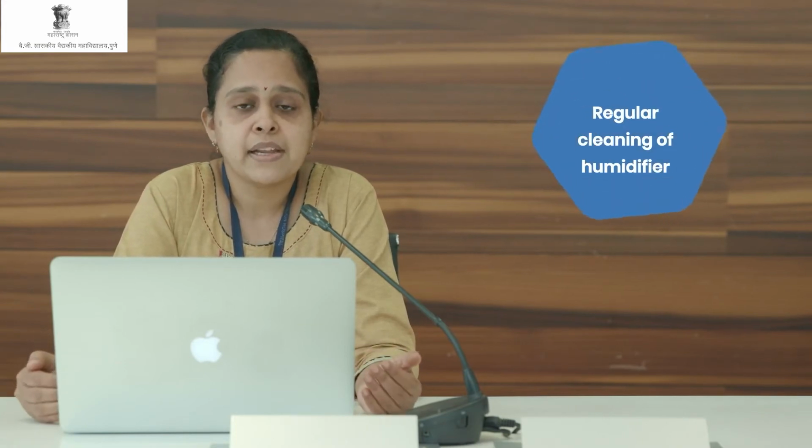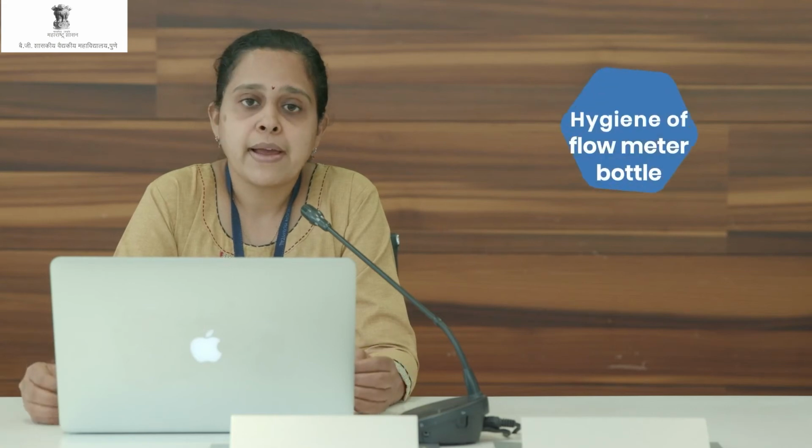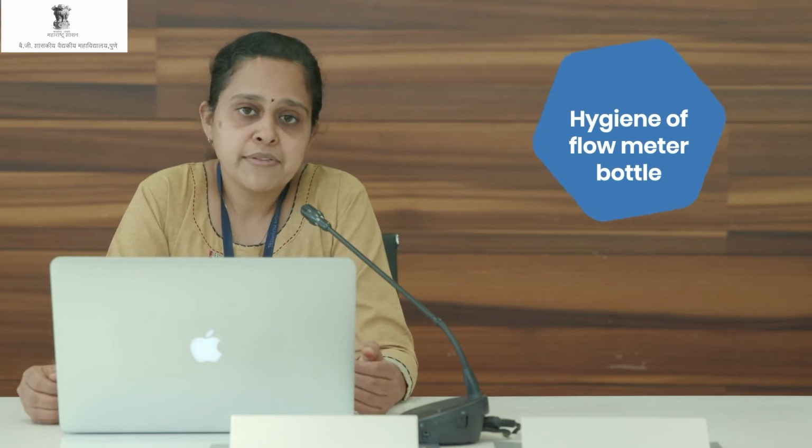Care of oxygen delivery system: regular cleaning of humidifier bottles. The recent upsurge of mucormycosis has led us all to introspect why this mucormycosis pandemic has occurred amidst this COVID-19 pandemic. Now one of the important reasons is the hygiene of the flow meter bottles. So if the hygiene is not maintained, then mucor can grow in it and it can invade the body tissues and create havoc. Like we have seen rhinocerebral forms, we have seen ophthalmic forms, and we have also seen in some patients aspergillus infection of the lung.